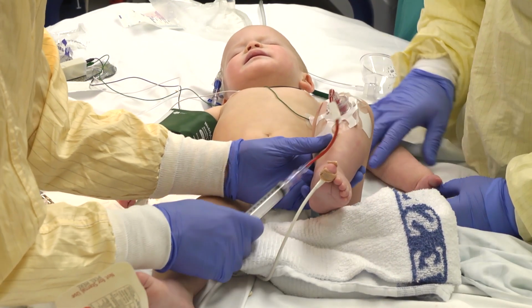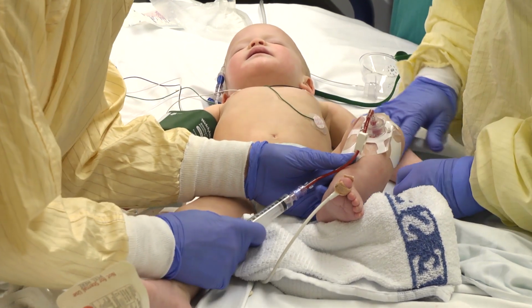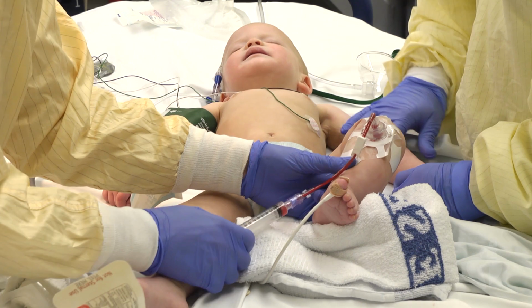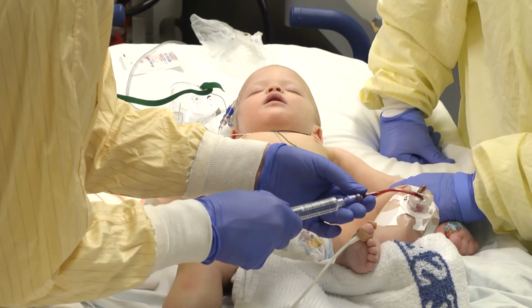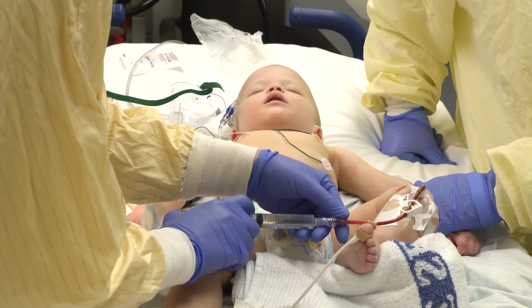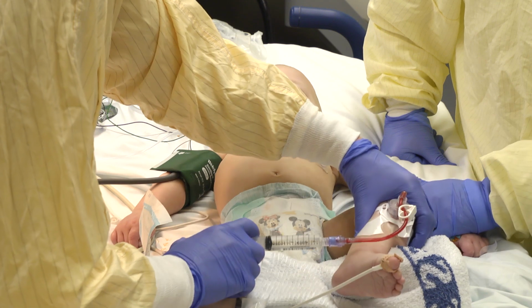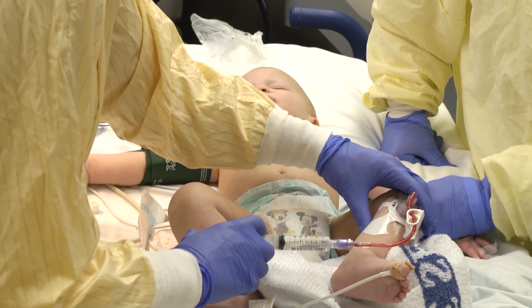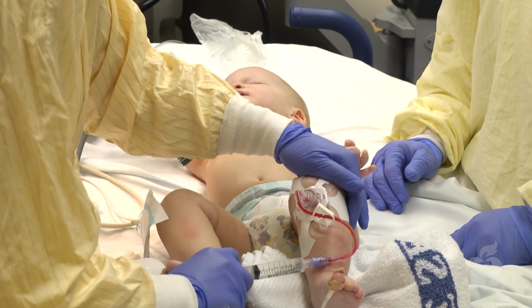Aspiration of the syringe may reveal pink-tinged fluid or blood in the hub of the needle. But if no fluid returns, it does not necessarily mean that the IO needle is incorrectly placed. Attach a saline-filled syringe and infuse a small volume while observing for swelling at the insertion site, and posteriorly in case the needle has penetrated the other side of the bone. Fluid should easily infuse with saline injection from the syringe.